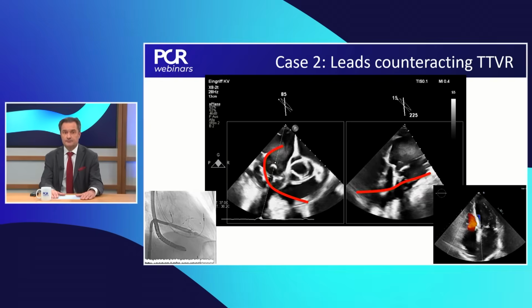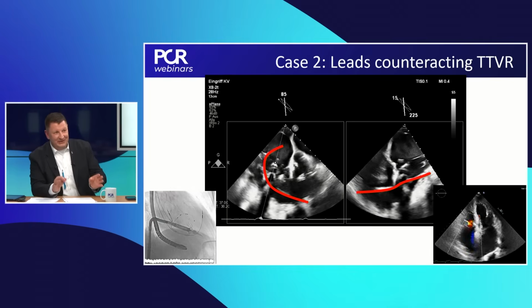Very good comment. So you fear any jailing of the leads in your hospital. But now we have, for example, an 85-year-old female patient with a 20-year successfully implanted pacemaker. We know that it takes time from the origin of the TR to the decompensation, and now the patient decompensates after 15 or 20 years. You have a lead-related or maybe lead-induced TR with a 20-year-old implanted system. How would you estimate the risk?